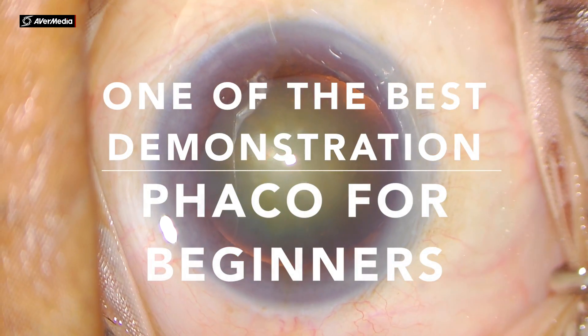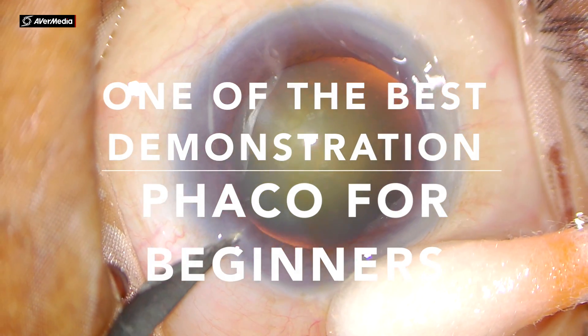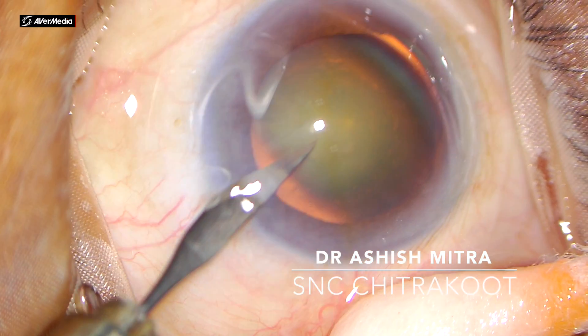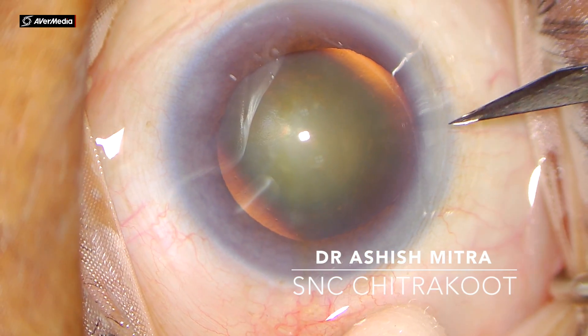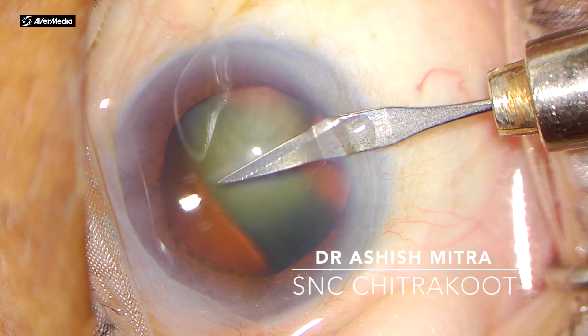Hello everyone, today I would be demonstrating cataract surgery phacoemulsification for beginners so that they can learn each step of the surgery and learn to perform them in the correct way. This is an unedited video and I would be doing all steps of the surgery slowly to demonstrate each step carefully.